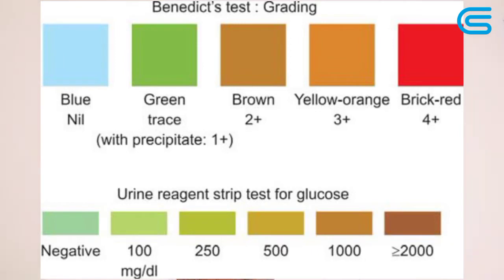So you have had that reaction. Glucose reacts with oxygen from room air in the presence of glucose oxidase that is present in the strip to form gluconic acid. After it has formed gluconic acid and hydrogen peroxide, the hydrogen peroxide produced then reacts with a chromogen in the presence of peroxidase to form oxidized chromogen that is blue in color, and water.